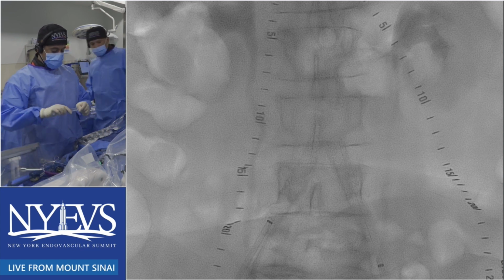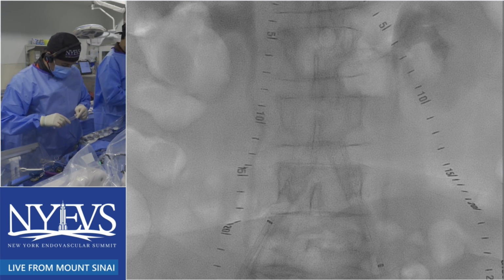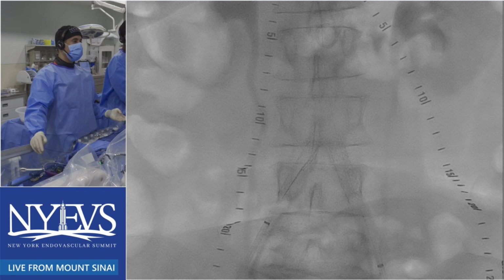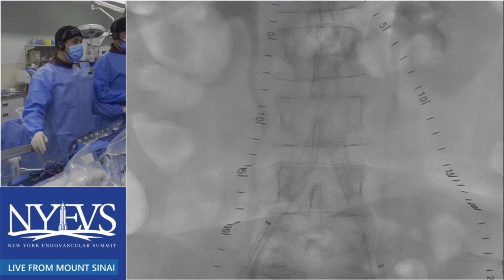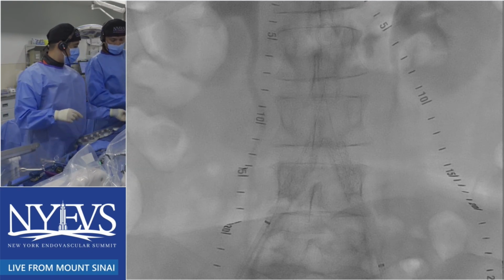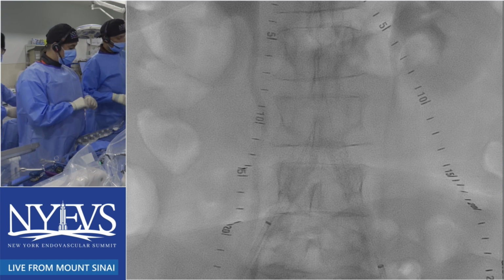If you want to do it correctly, then you start measuring. If you obviously measure a gradient, then you still need to do something. If you don't measure a gradient, then you still need to give some vasodilation in order to give a kind of walking exercise. We had been talking about measuring gradients here because when Chris did an angioplasty through that iliac artery, he completely eliminated the gradient. The gradients should make you feel good that you've helped things, but they don't.